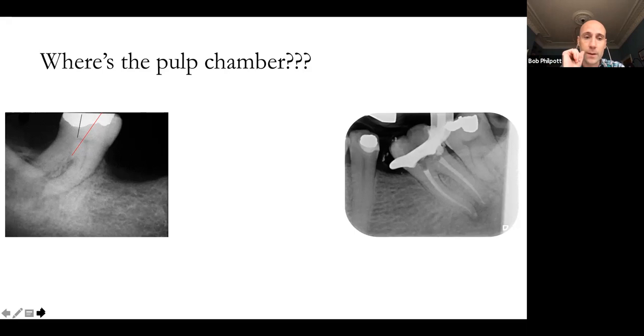The reason is that I am either terrible at counting from 1 to 8 or 9, which is roughly what your distance is, or it's never accurate, either because the software isn't calibrated perfectly, or because where you're putting your little cursor is not exactly where you need to be three-dimensionally in your tooth. It adds a false sense of being definitive with something that really is a fluid thing as you access into the tooth.